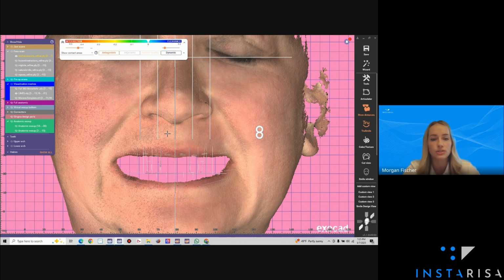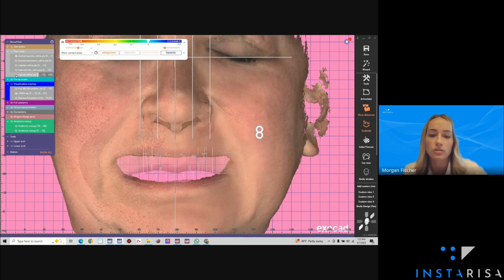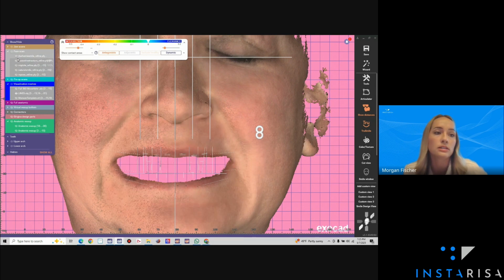Sometimes we don't have 1 to 2 millimeters of incisal show at rest because I would rather not have a gummy smile. So we're just kind of balancing these things. Everybody's face is different. Everybody's lip mobility is different. In this instance, it looks like her incisal edge being at 1 to 2 millimeters aligns really well with her Duchenne smile. She's not showing a lot of gums on the upper.